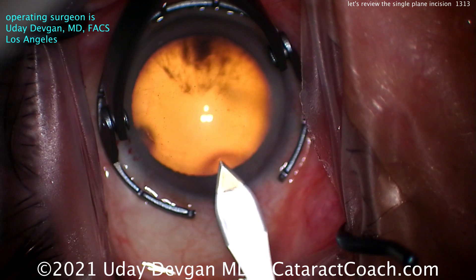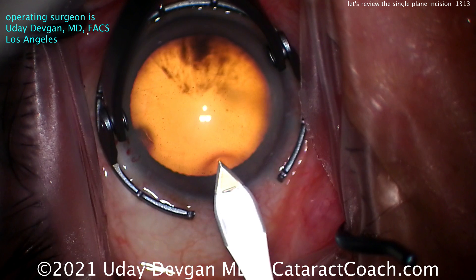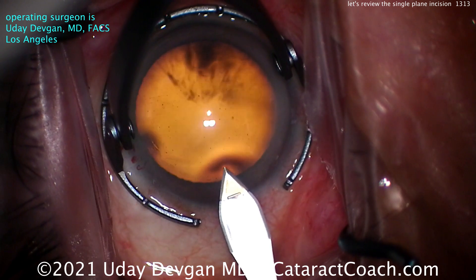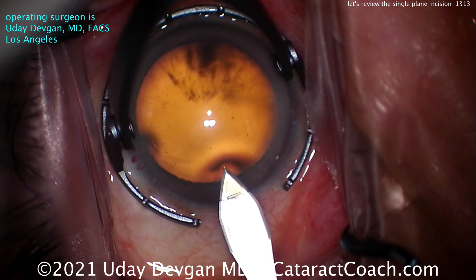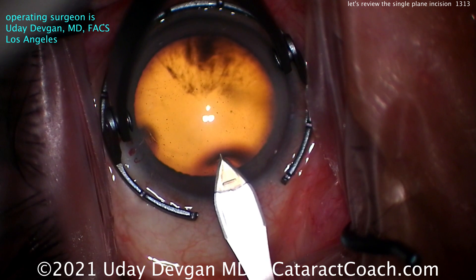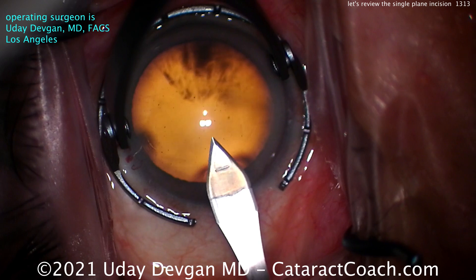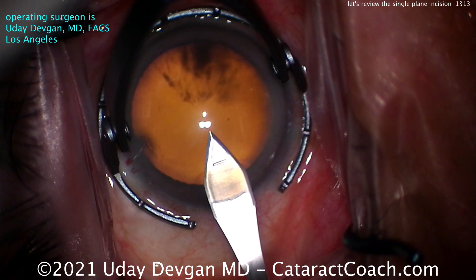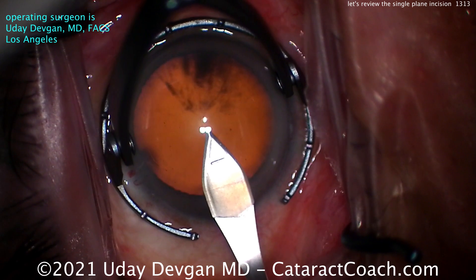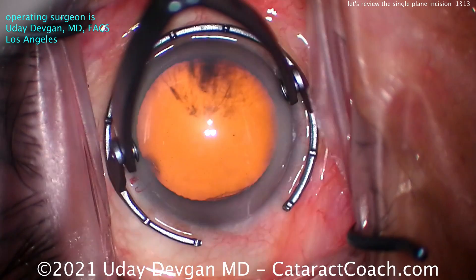It distorts a little bit. That tells me we're right about to penetrate Descemet's. So now, if you want to, push the whole blade slightly towards the floor of the room — like that — and now enter the eye. Look at the outline of the incision: a perfect rectangle, a perfect square. Beautiful incision.